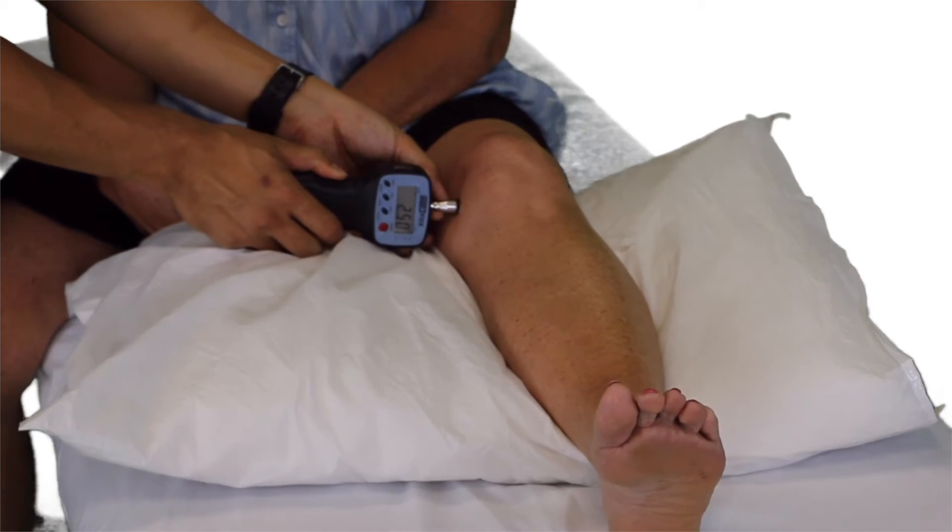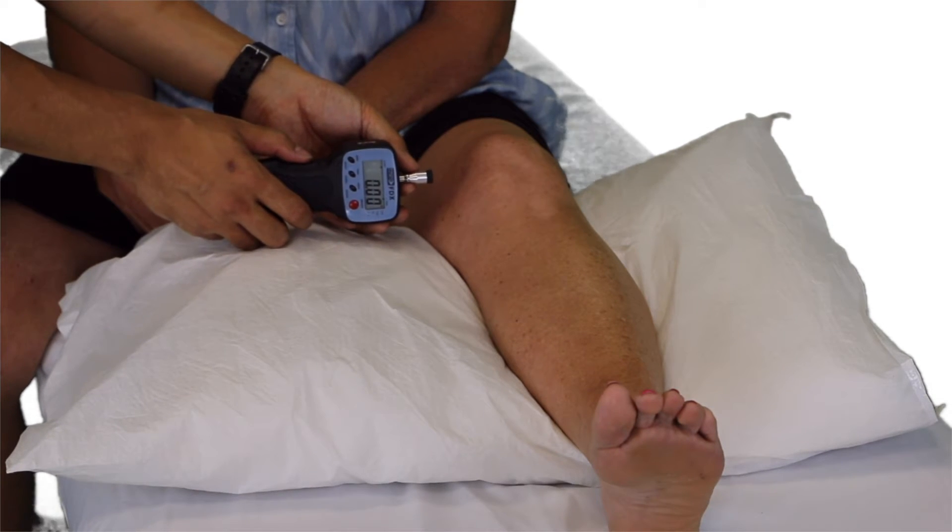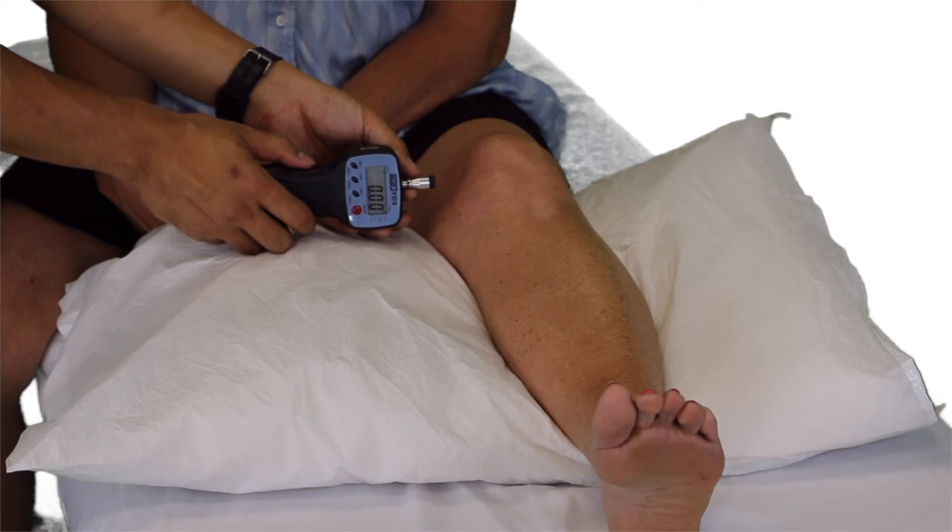Three applications are given with 30 seconds break in between to reduce wind-up. The average of the three findings is then recorded.